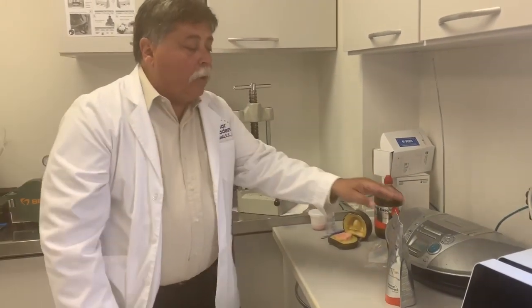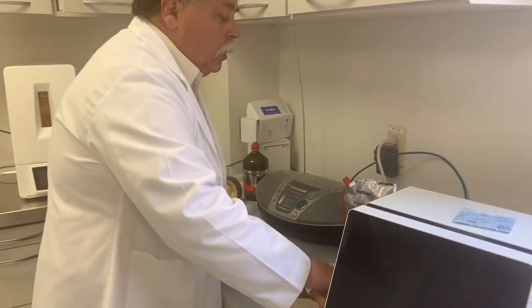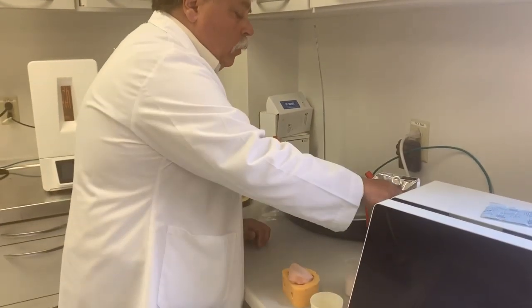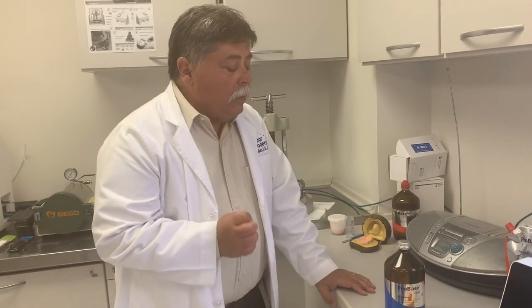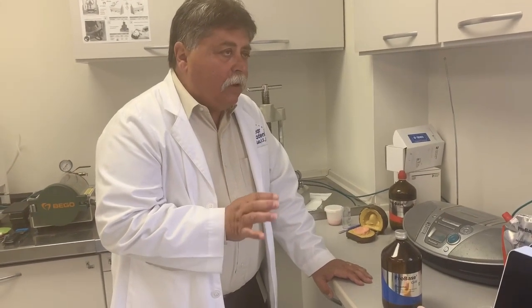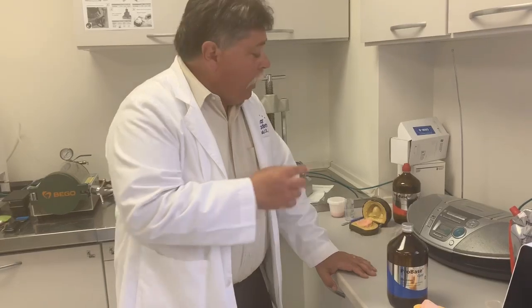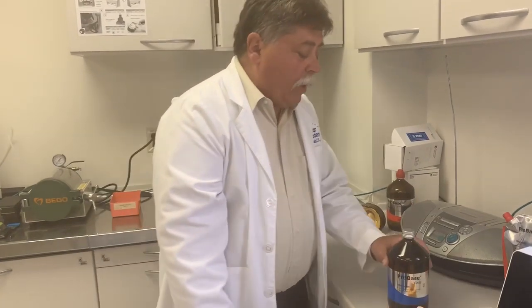In the meantime, we're going to do another denture. Another way of doing dentures is with what's called a cold cure. This doesn't require a lot of heat to set up, so it isn't as dimensionally stable over time as the heat cured. It's going to tend to warp and break down over a shorter period of time.